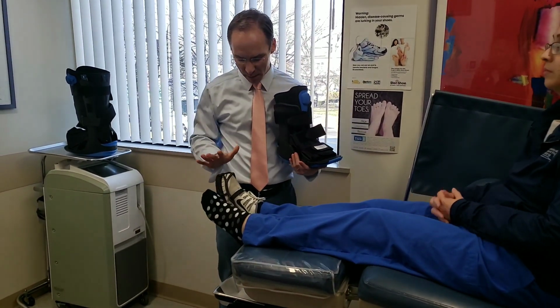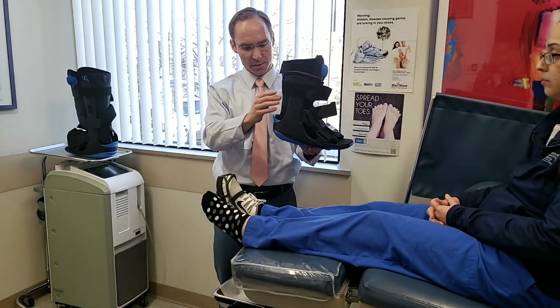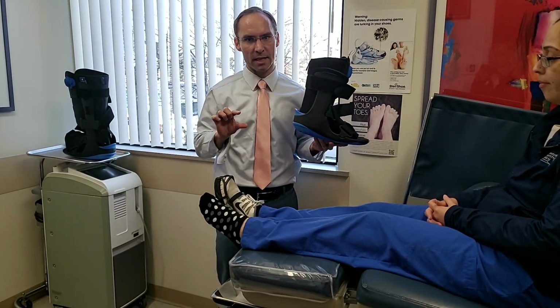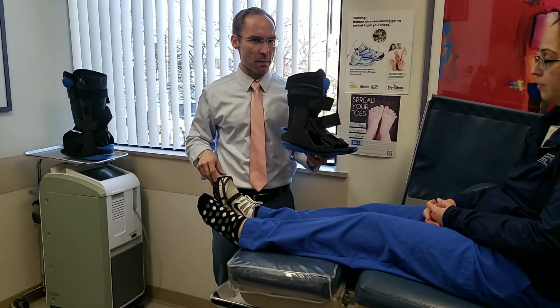And also remember, we always have people get an even up with this, so you're not thrown off. Because if you notice, there is a nice little heel to it. So you can either wear a shoe with a little bit of a heel, like a high heel if you're a woman, or you can get one of these even ups, which usually works a little bit better.